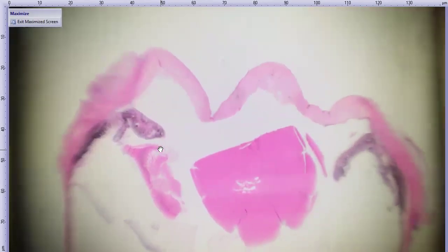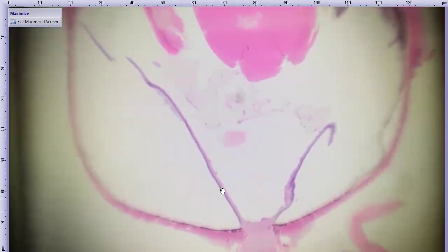But they were fairly similar histologically. So again, cornea at the top. Here our lens is a little bit better sampled, but we'll take a closer look at it as well. We have the vitreous here and the retina here as well, which is maybe looking a little shaggy. There's some stuff clumping around on the outside here. The same with a little bit here in the vitreous. There's a little bit of purpleness here, and maybe along our uvea as well.